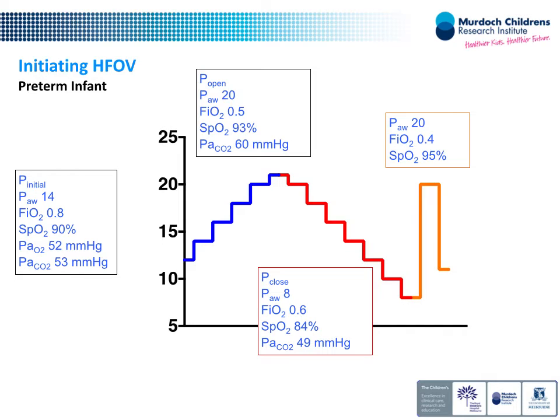And this is something to discuss, but we could pick any of these settings theoretically, because anywhere from 18 down to 10 gave us good oxygenation, didn't it? The question is, what do we pick? And I put it to you that the safest place to stand on a cliff is not at the very edge, right? We all naturally stand a few steps back.